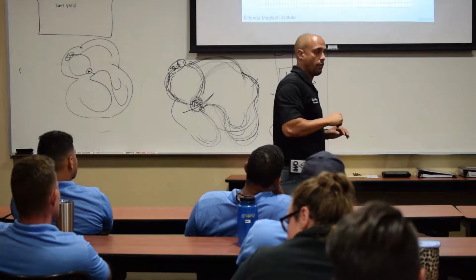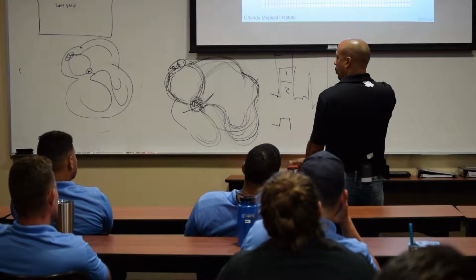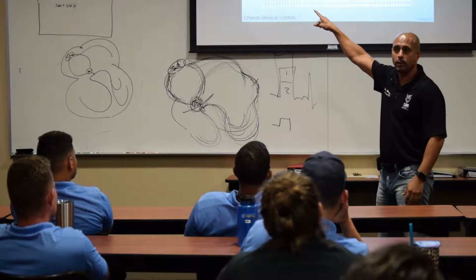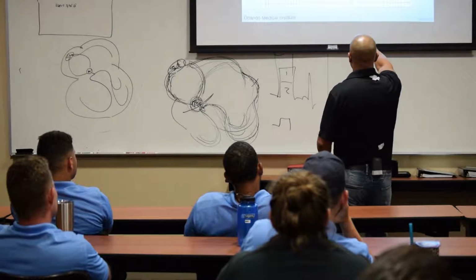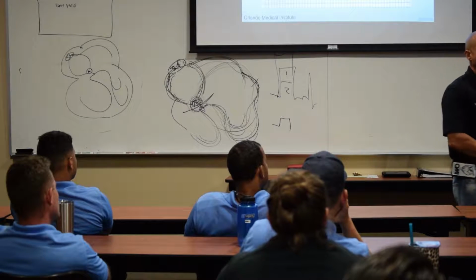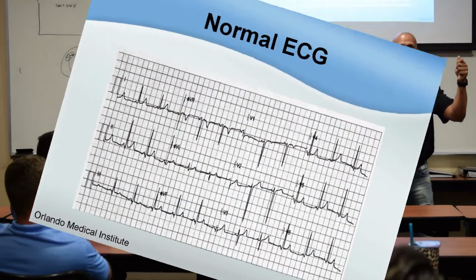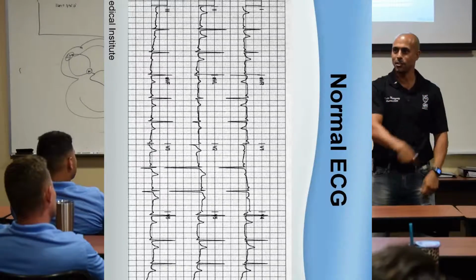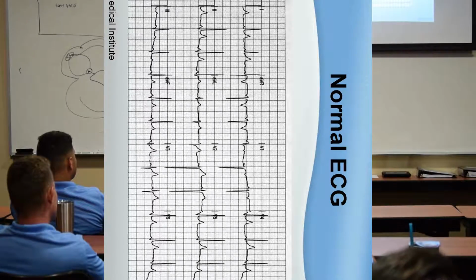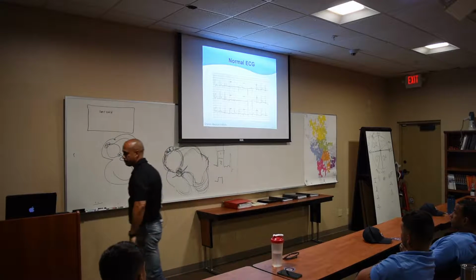I'm going to tell you about something real bizarre. It's in your vehicle. It's called the signal light thingamajig. So if I want to make a right turn, which way do we hit the signal light? Up, right? So if my deflection is upright in V1, then it's right bundle branch block. If it's down, make a left turn, then it's a left bundle branch block, right? Or if you take this ECG I'm looking at and turn it clockwise, which way is your ECG facing? If it's facing towards the left, it's left axis. Facing towards the right is right axis, right bundle branch block versus left. You know what I'm talking about? Take the ECG and just turn it, and then you can see.